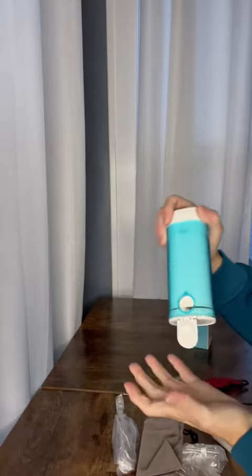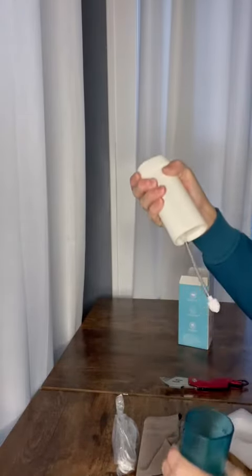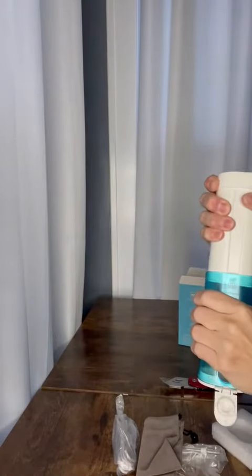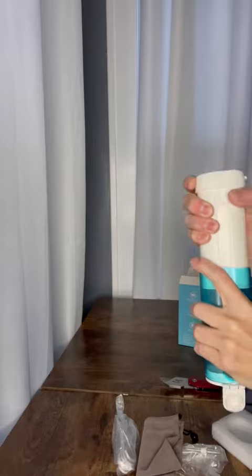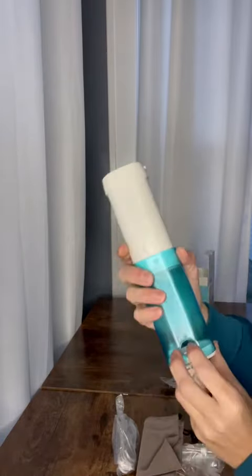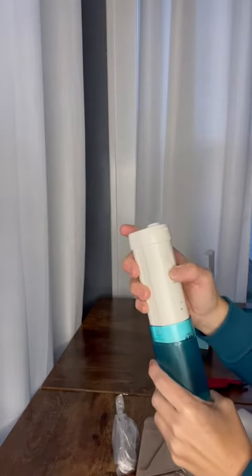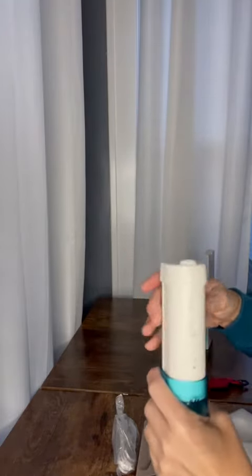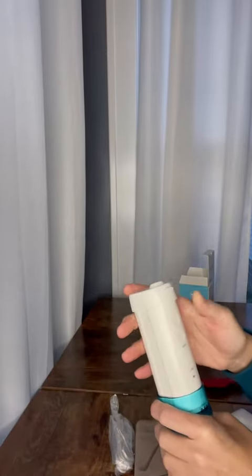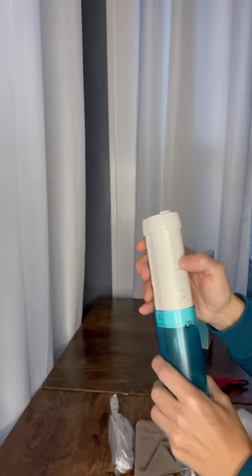You just unlock this, you've got your inside here, you can just pop it back, it locks into place about there. So then you have your full size — you add your water here, close it up, power it on, after you put your tips on.